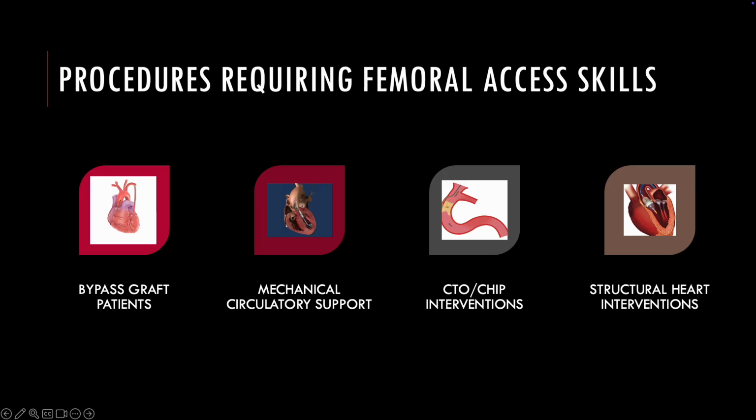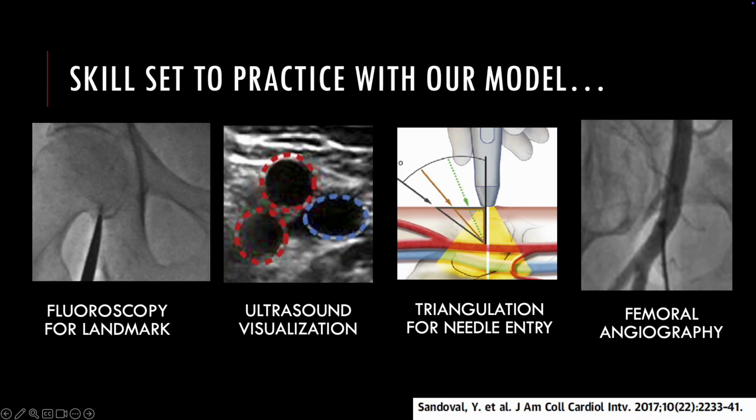A number of cardiac interventions and procedures require femoral access skills, including bypass angiography, mechanical circulatory support, CTO chip interventions, structural and peripheral interventions. It is crucial that best practices are adhered to minimize vascular complications for our patients. A number of different tools can be used to perform safe femoral access, including fluoroscopy, ultrasound visualization, triangulating the needle properly, and performing femoral angiography.